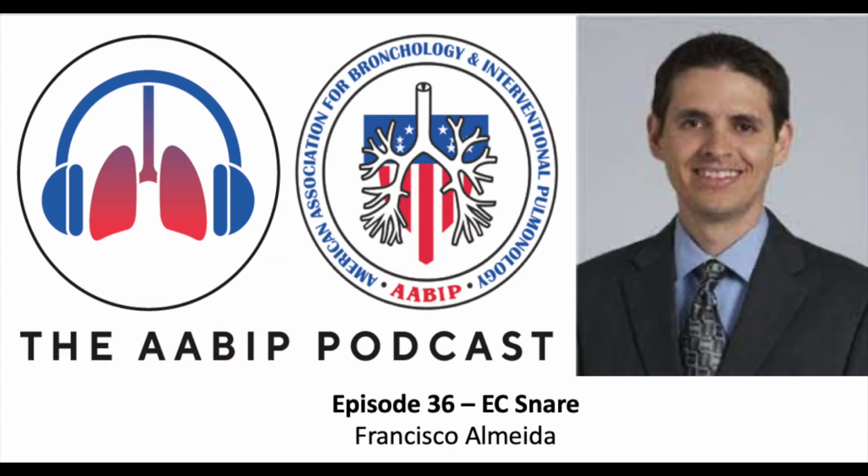Yeah, so I mentioned coagulation, but that's a great question. I didn't mean necessarily using the coagulation setting, because to be honest, I've been using snares for over a decade, and I don't remember if I ever used a coagulation setting. Or let me rephrase that. I probably have used it once or twice, and I wasn't very impressed with the way it cut the lesion. So I use virtually, and it is already preset on our machines for cut. We just set the cut. The option is already there. And that's what I use virtually 100% of the time.